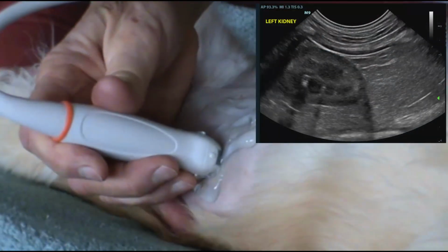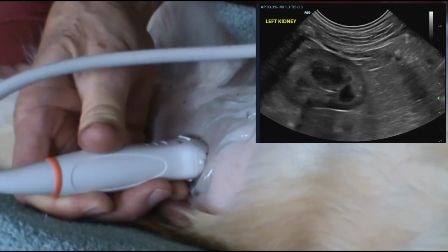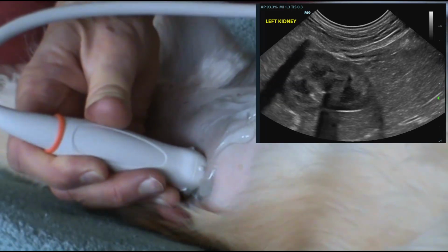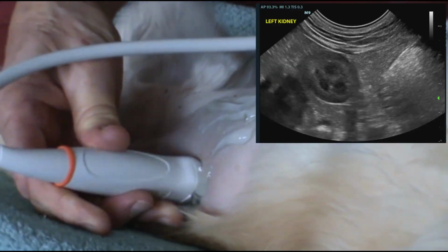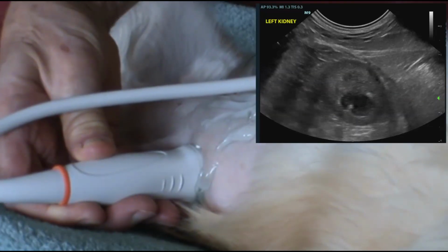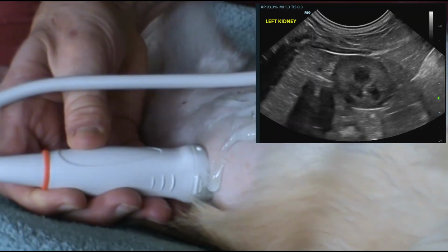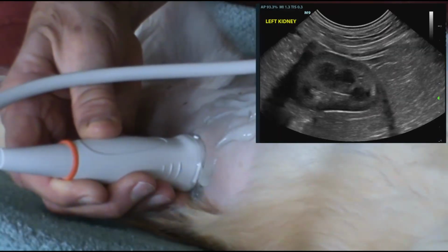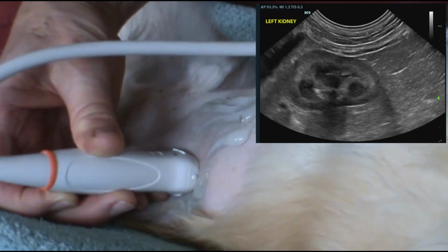Fan the transducer ventrally until the kidney is no longer seen. Then reverse direction and fan dorsally till the kidney is no longer seen. Return to the initial position bisecting the kidney. Rotate the transducer 90 degrees counterclockwise to a transverse position. Fan cranially, then caudally until all kidney tissue has been seen. Rotate the transducer 90 degrees clockwise back to a left lateral sagittal position over the left kidney.